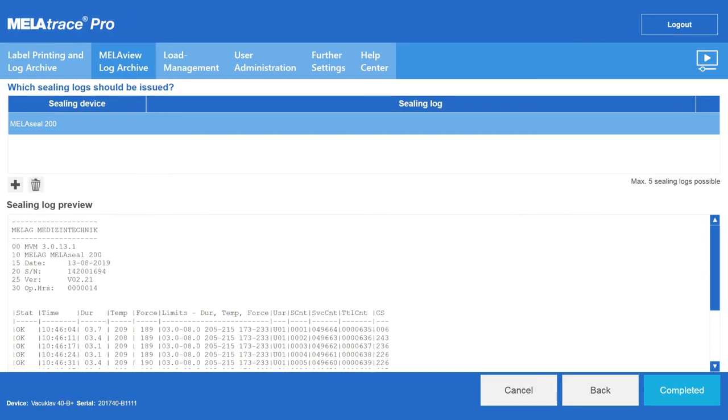The sealing log is displayed in the MELAtrace Pro preview window. You can start the steam sterilizer after confirming your entries with completed.